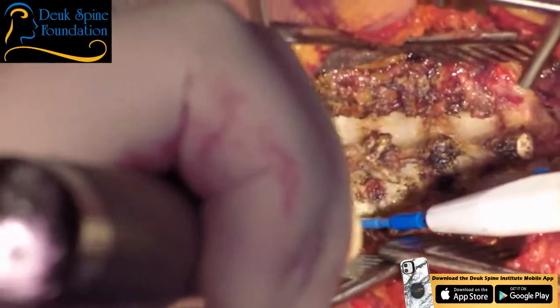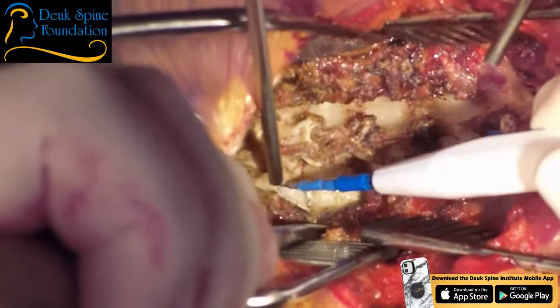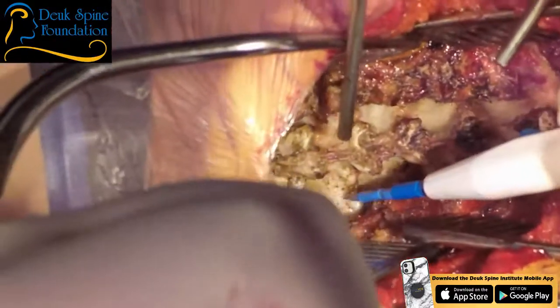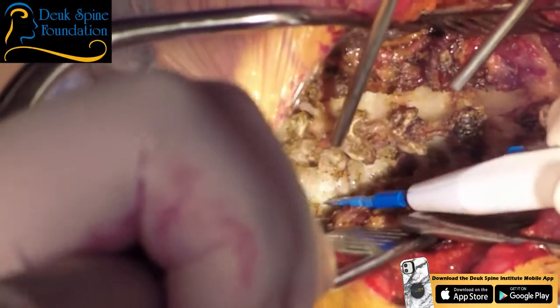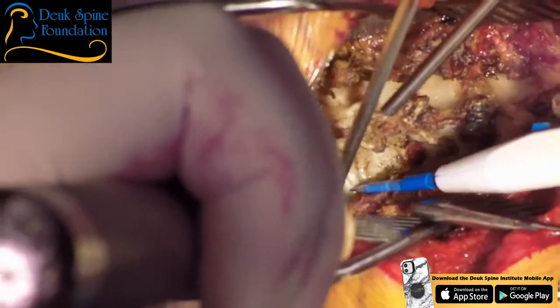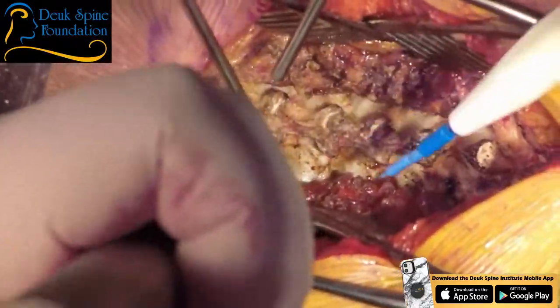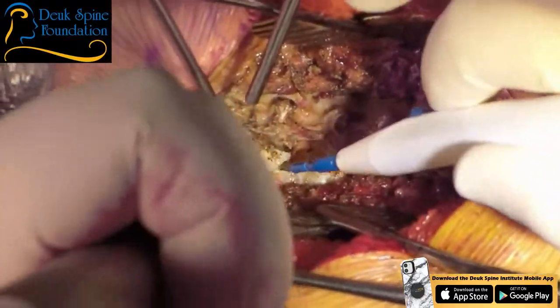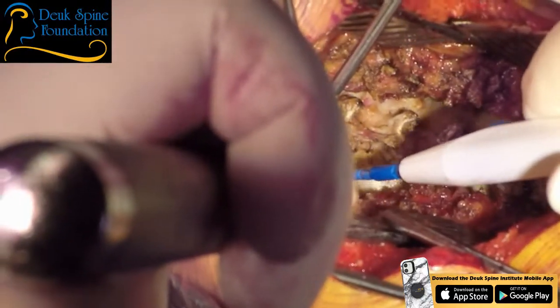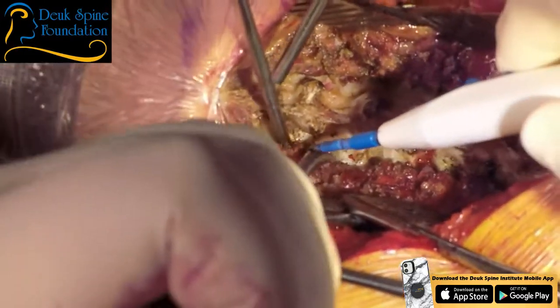And it's important that we do that because, number one, we need a surface to fuse. So you want to expose all the bone to the lateral margin, because we're only doing a posterior fusion here. We're not going anterior. So you only have the posterior surface of the bone to fuse, and we're getting rid of the lamina. So you really only have the lateral masses to fuse. This is C3 here. So you only have the lateral masses and the facet joints that you can use for fusing.